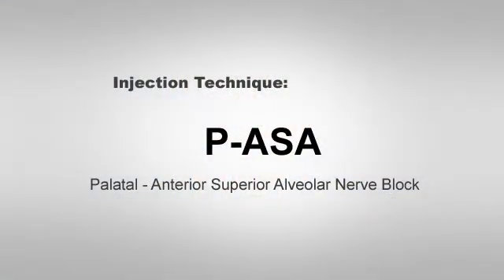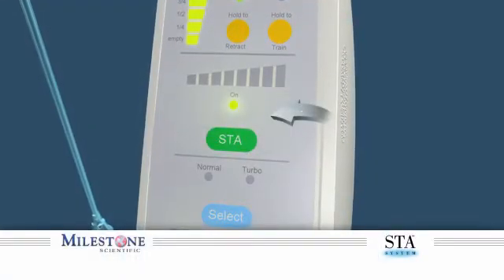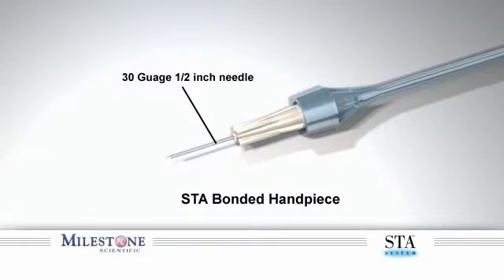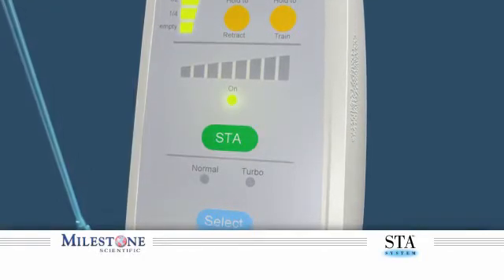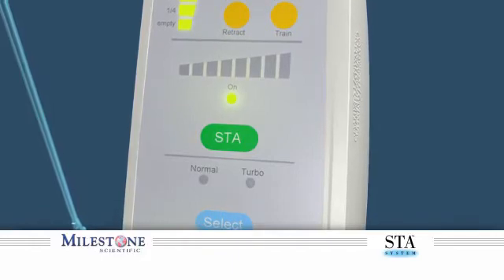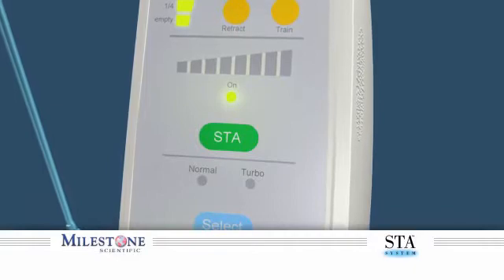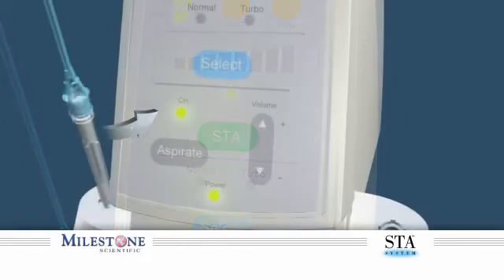Injection Technique — PASA or Palatal Approach Anterior Superior Alveolar Nerve Block. Before you begin, verify the STA system is set to the STA mode. It is recommended that you use the 30-gauge half-inch bonded STA1 handpiece for this injection. It is critical to use the STA mode to ensure that a safe and controlled single flow rate is maintained throughout this injection. Delivering the anesthetic at a faster rate than the control flow rate can result in adverse tissue reactions and tissue damage.